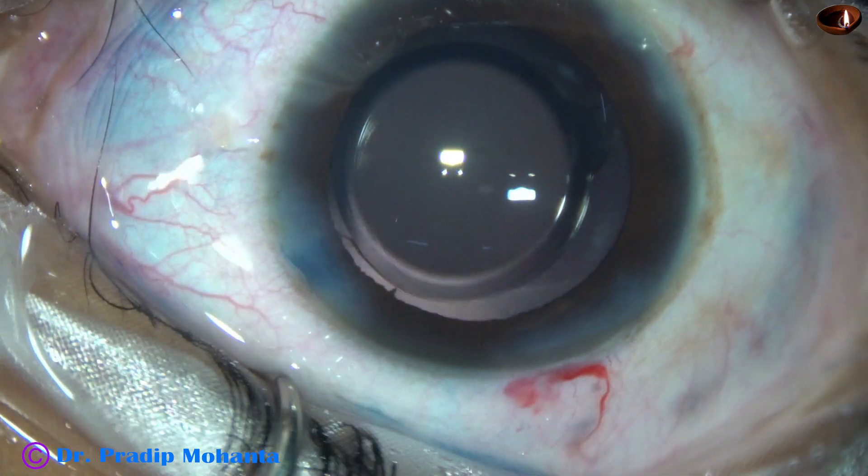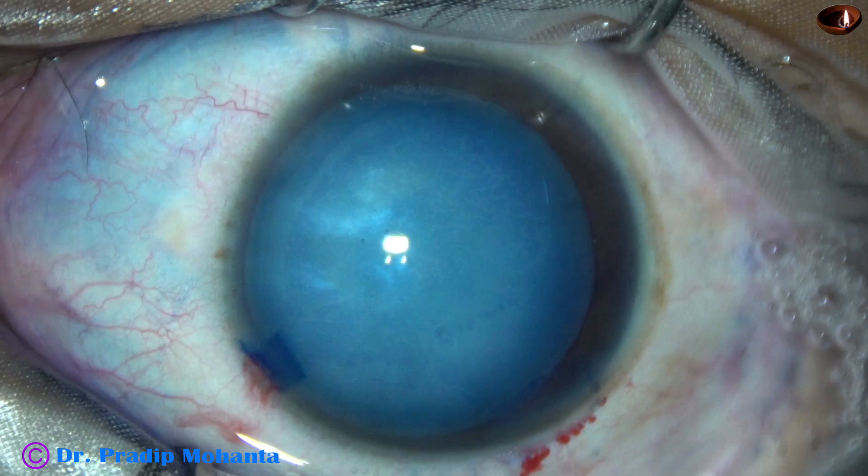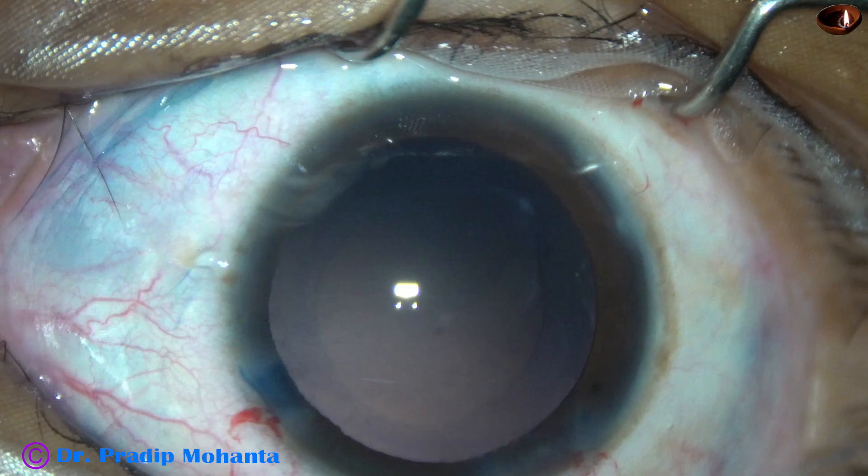Thank you very much for your attention. Hope this video will help you in developing your surgical skills. In this video, we have seen that trypan blue dye does stain the corneal endothelium, and later on it tends to get washed off.